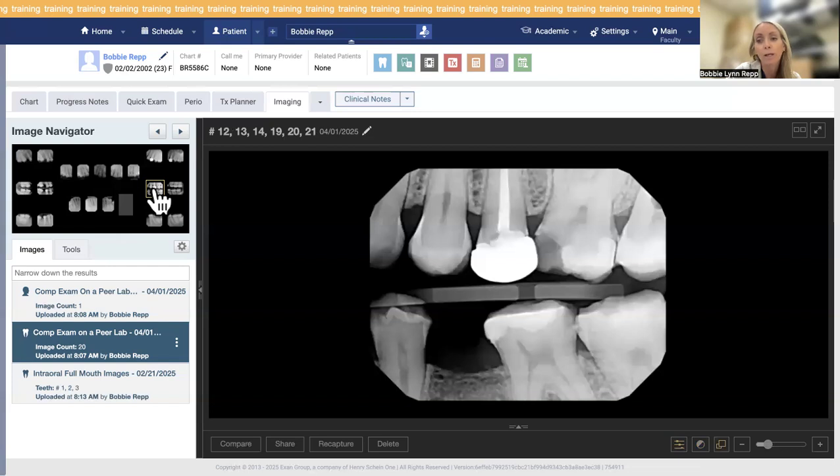So go in, complete this to the best of your ability. This is not graded based on being right this time because it's so new with your lecture just recently with Dr. Shackelford. It's basically just getting you into the practice of looking at images, making notes before your patient even comes into the clinic, and being able to describe what you're seeing, and then also getting you into the routine of kind of systematically working through these images.